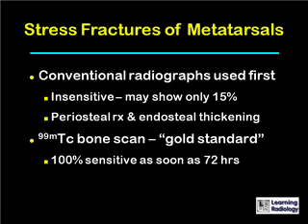Technetium 99M bone scans are considered the gold standard. They are virtually 100% sensitive, and they are sensitive to stress fractures as soon as 72 hours after the injury. Unfortunately, they're not as specific as they are sensitive, so conventional radiographs need to be obtained in association with the bone scan.